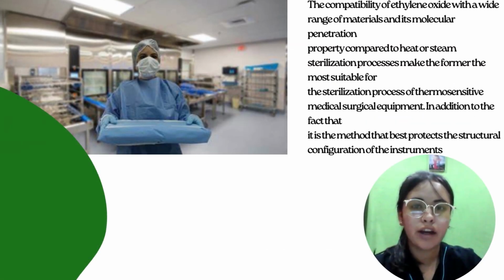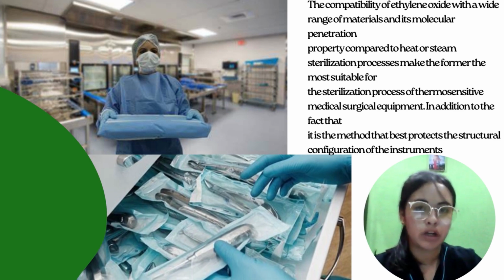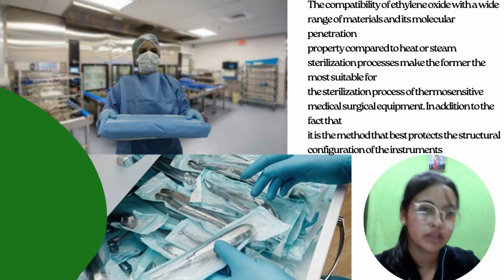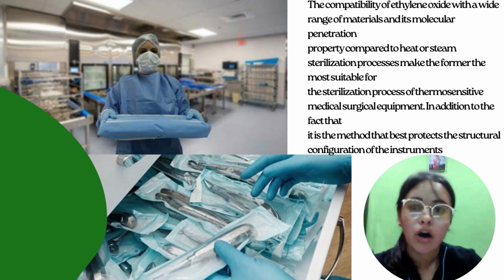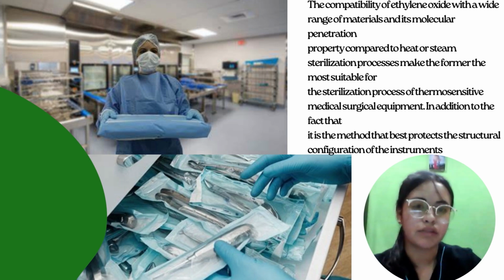The compatibility of ethylene oxide with a wide range of materials and its molecular penetration property compared to heat or steam sterilization make it the most suitable for the sterilization process of thermosensitive medical surgical equipment, in addition to being the method that best protects the structural configuration of the instruments.